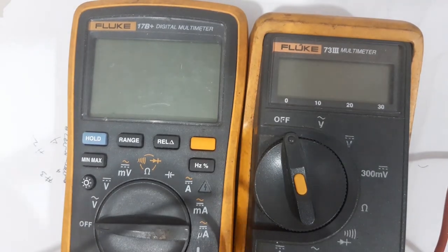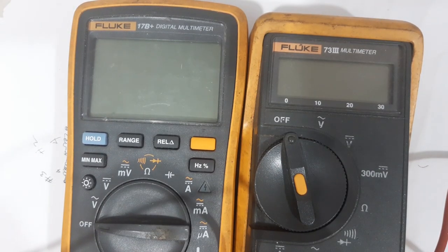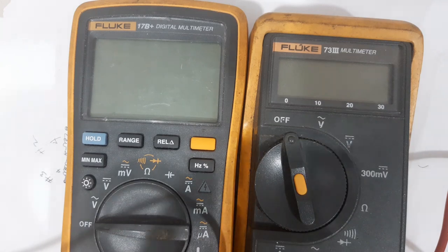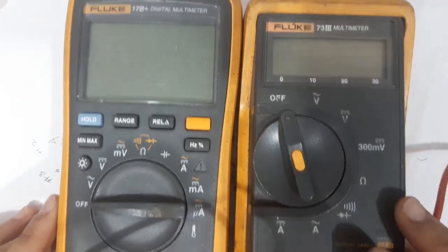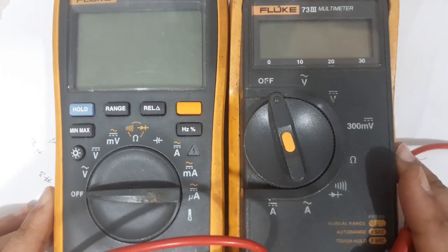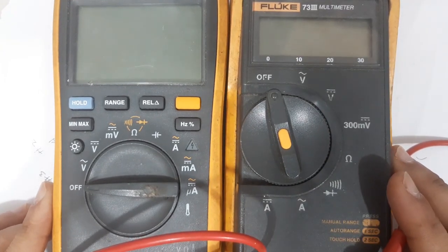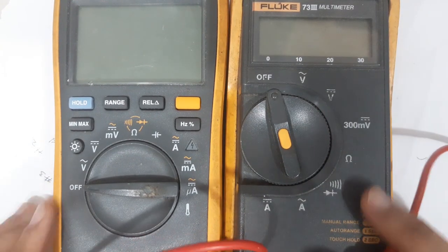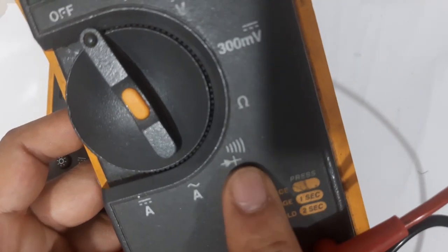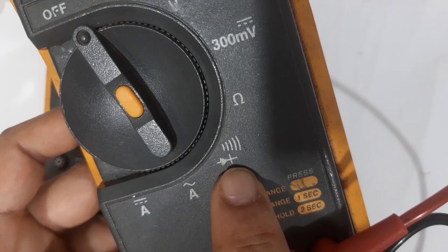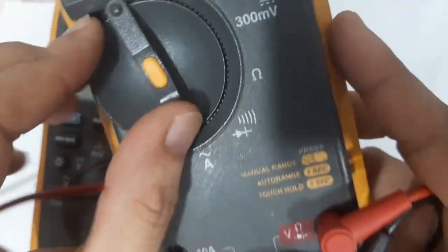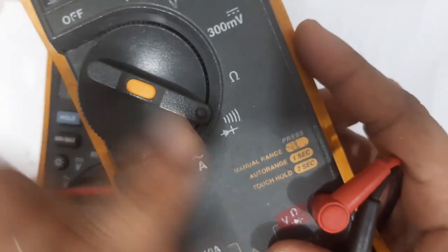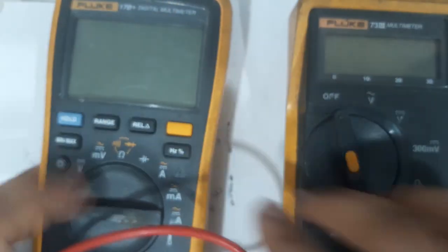I have here two Fluke multimeters, and this one is the older model, but I like to use this one for checking shorts on components because the diode mode and continuity are in the same position. When you rotate, they are the same, not like this one.